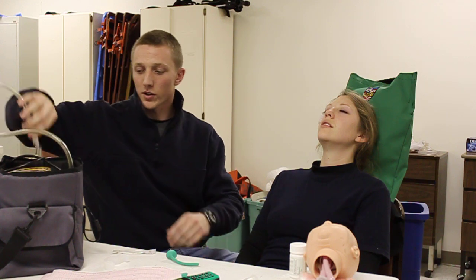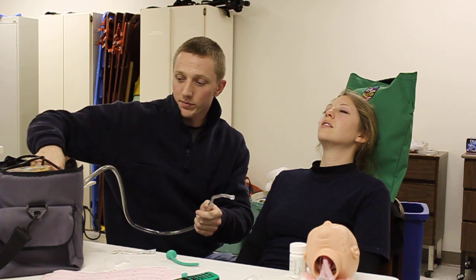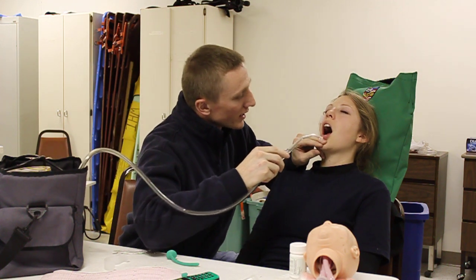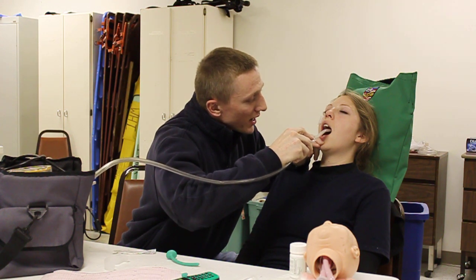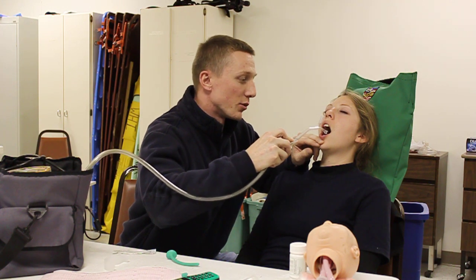You need to go ahead and demonstrate how to suction the patient's airway at this time. I'm going to go ahead and get my suction ready, dial my suction up to 300 millimeters of mercury, and test suction against my glove hand. Once I have test suction, I'm going to go ahead and insert no further than I can see, apply suction in a circular motion, suctioning no more than 15 seconds on the way out.